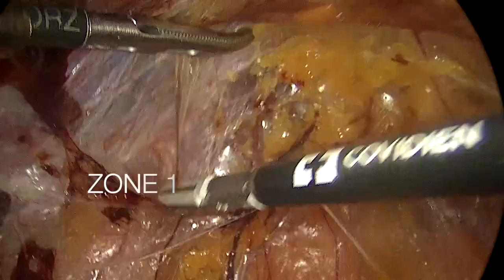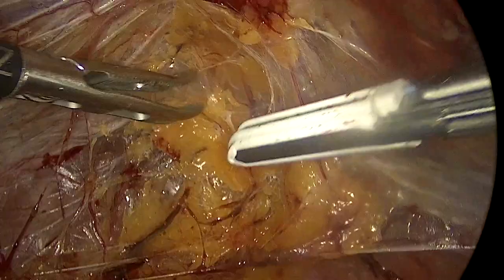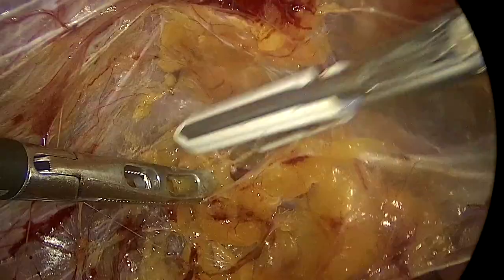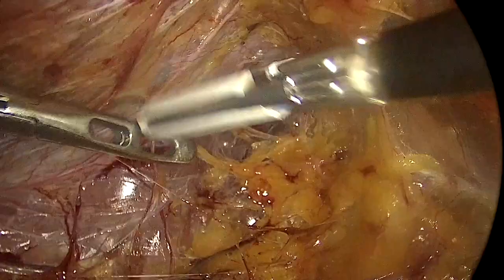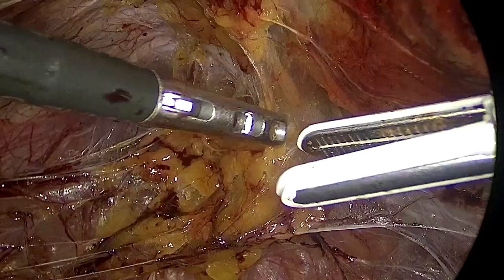Just like in previous cases, I'm doing this on top of the median umbilical ligament. The maneuver here is to scrape off or peel away the peritoneum from the fascia, very gently, trying not to progress too laterally so I can stay in the area where the peritoneum is thicker and less likely to break.